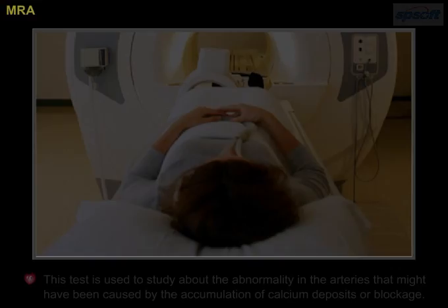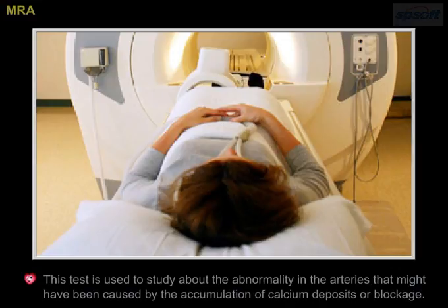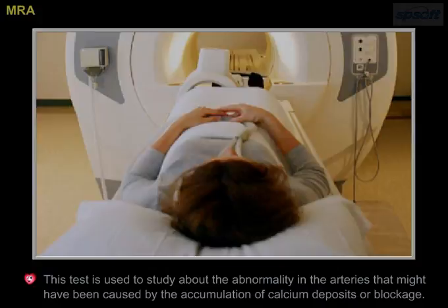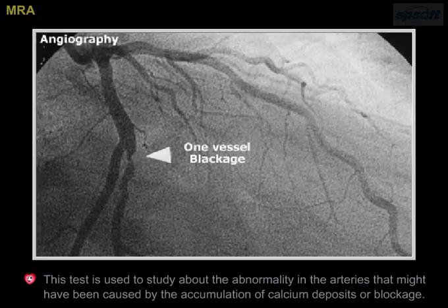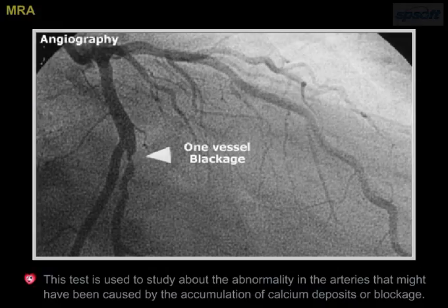MRA. This test is used to study abnormalities in the arteries that might have been caused by accumulation of calcium deposits or blockage.